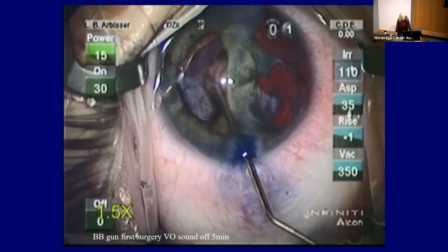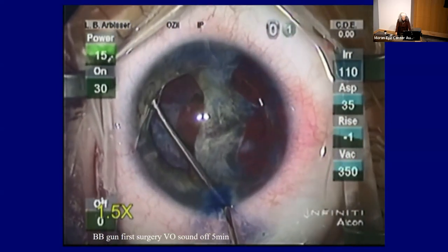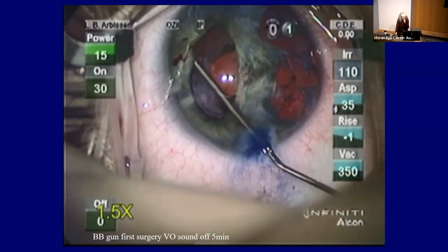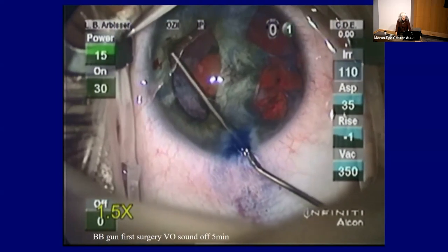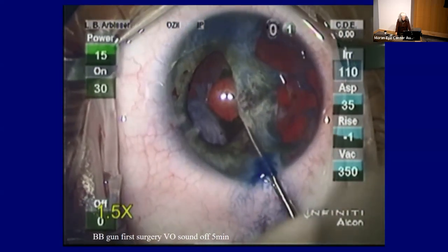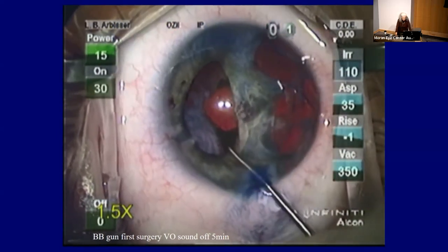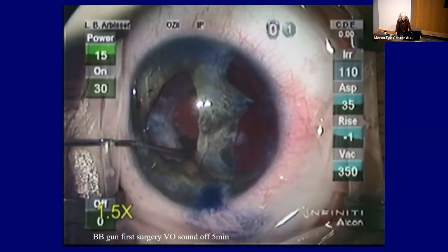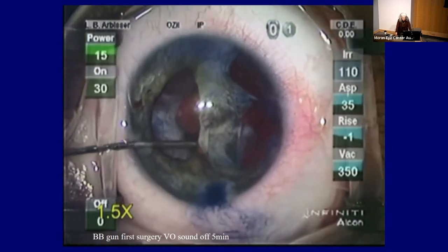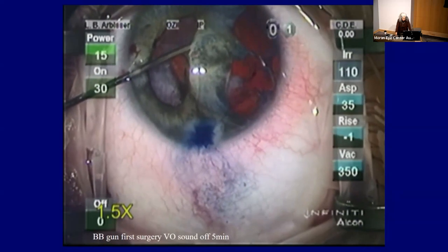Now I can see that I have some anterior capsule above, and I'm breaking the posterior synechia of that upper area of the iris. I don't know what's going on below, really. I don't see any hole in the posterior capsule as yet. This is highly edited, of course, so I may have used some Triessence in between, I'm not sure. But of course we're filled with OVD, so it's not all that helpful at that point. It can block your particulate identification of vitreous. That's why I put the Triessence in first, before the OVD.